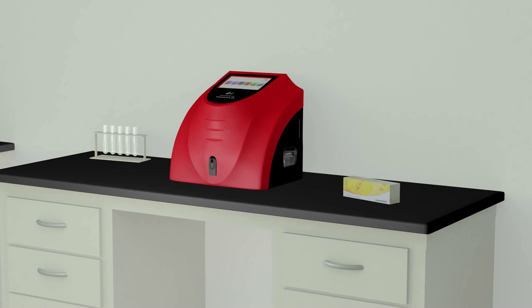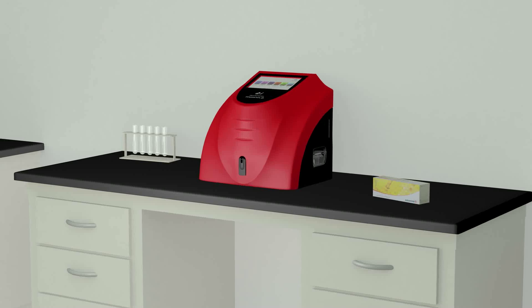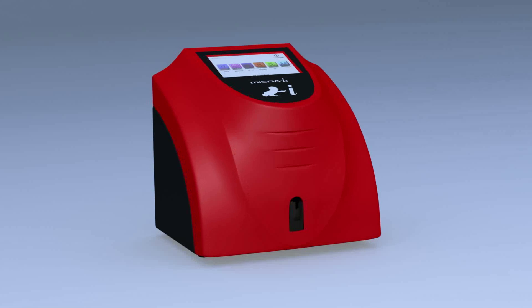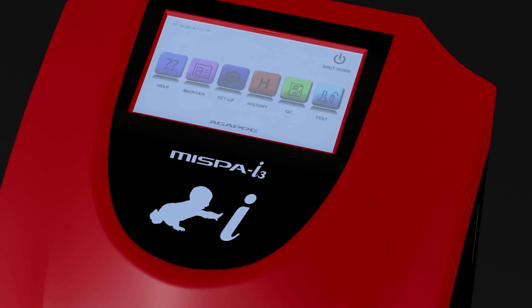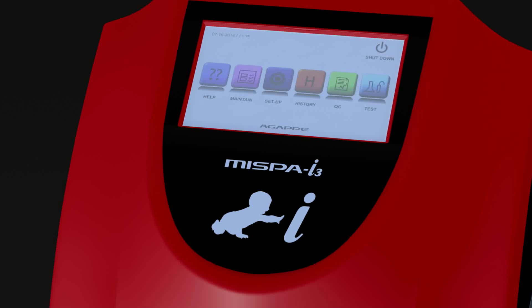With its small footprint and no hidden compressor, MISPA i3 can be placed on a small bench in the lab. The analyzer is very user-friendly with simple step-by-step instructions displayed on a bright backlit screen.